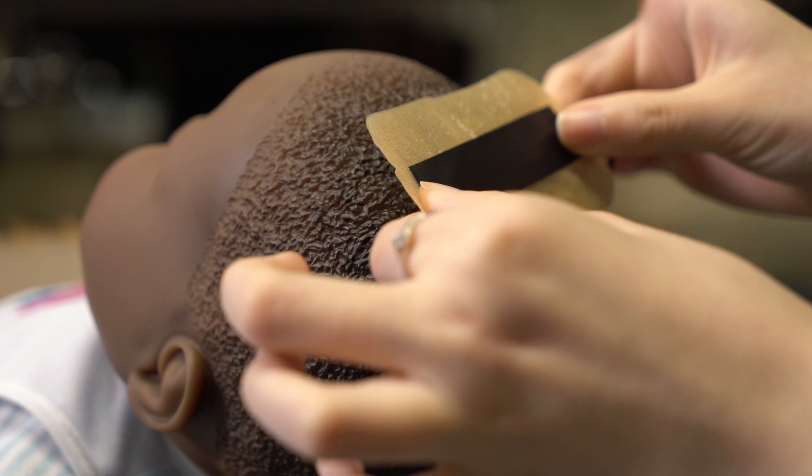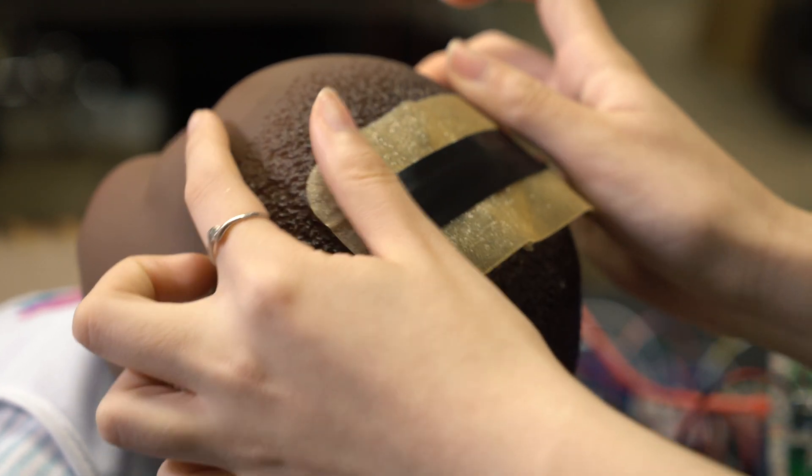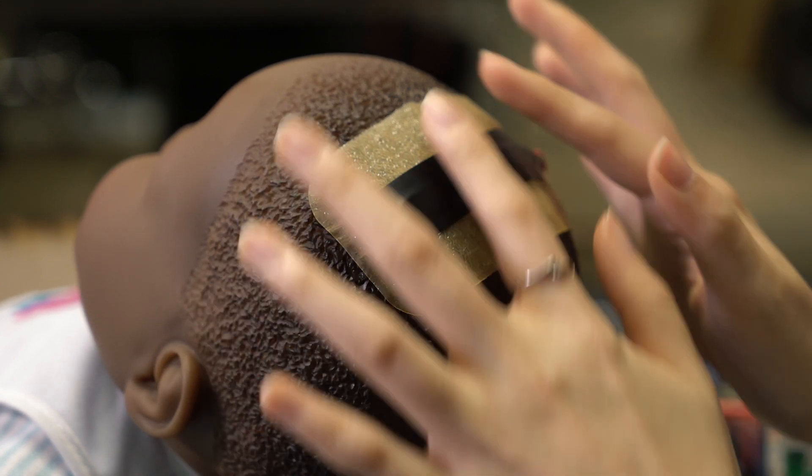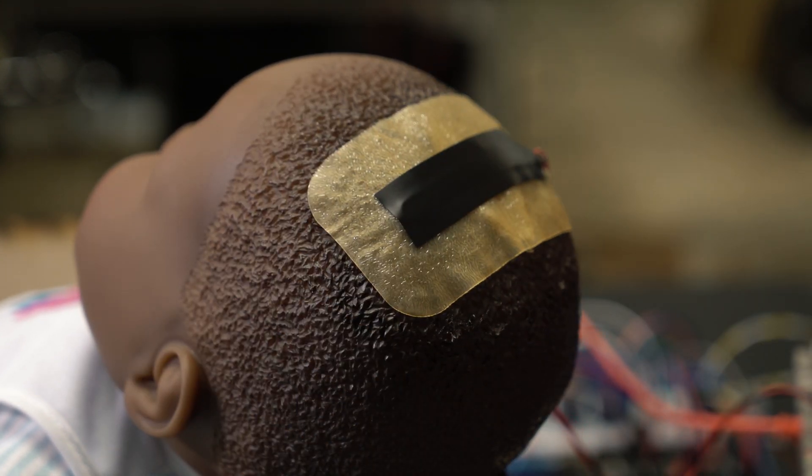It can last at least seven days. It can stay on the patient's head and continuously measure the intracranial pressure for seven days, and we would place it on top of the baby's fontanelle.